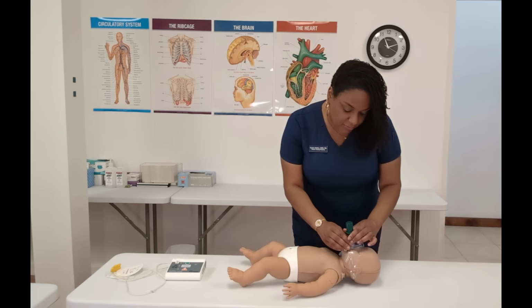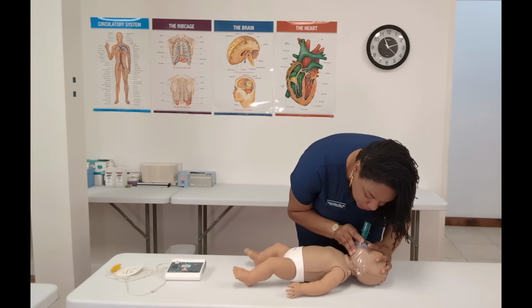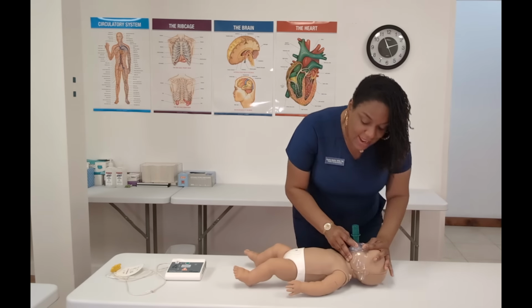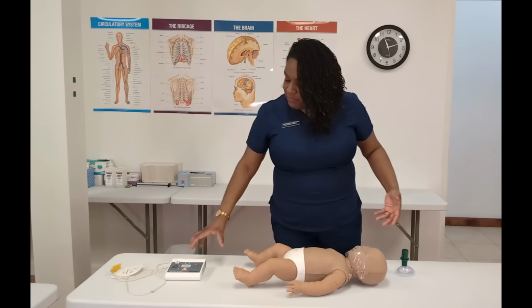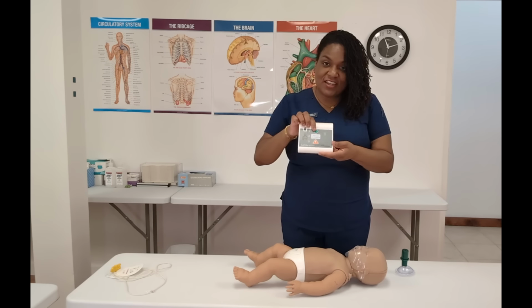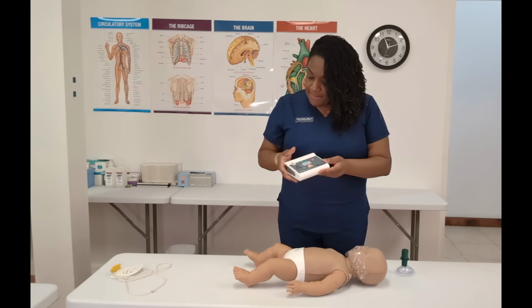When I administer those 2 breaths, press, tilt, and I would continue doing this until help arrives. And my help just arrived with the AED. If you recall from the previous video, we're going to power it on.